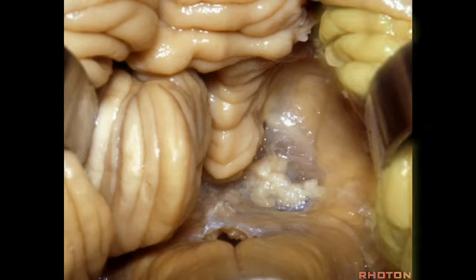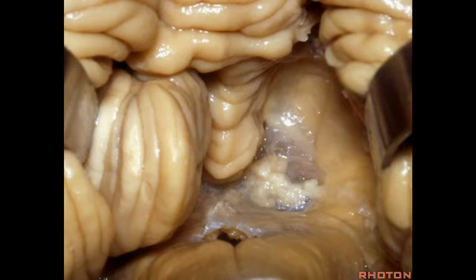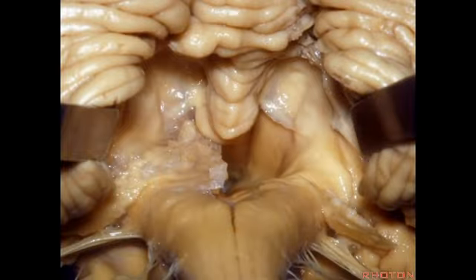And we found if we retract the tonsil, you see the inferior half of the fourth is made up of the inferior medullary velum that sweeps from the nodule to the flocculus, and the tela choroidea, in which the choroid plexus arises. And here we've opened the tela that forms the lower half of the roof of the fourth, and that gives a view all the way up to the aqueduct.